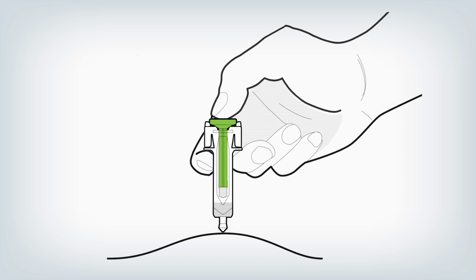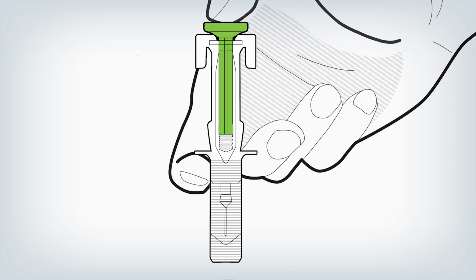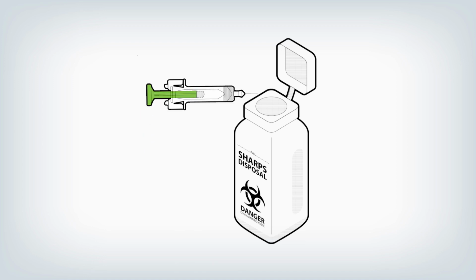When the plunger is pushed all the way down, keep pressing down on it to be sure all the medicine is injected before taking the needle out of the skin at the same angle as inserted. Once the needle is removed completely from the skin, release the plunger, allowing the needle shield to extend and cover the needle. If the plunger is not fully depressed, the needle shield will not extend to cover the needle when it's removed. Do not touch the needle and carefully place the syringe in your sharps container to avoid injury with the needle.